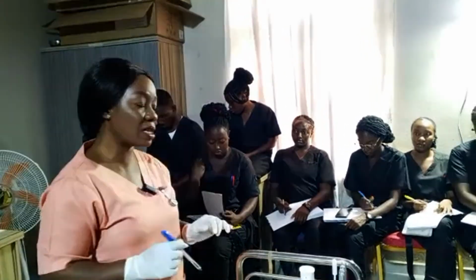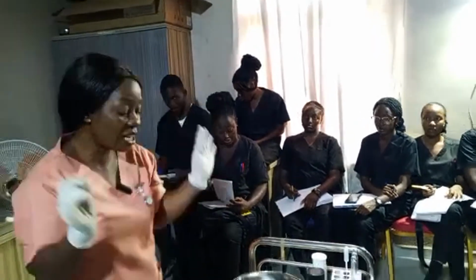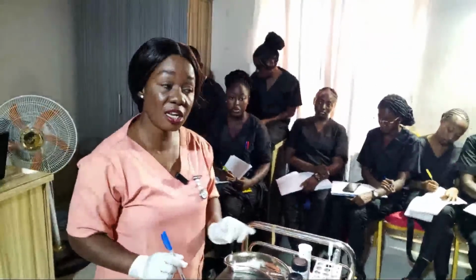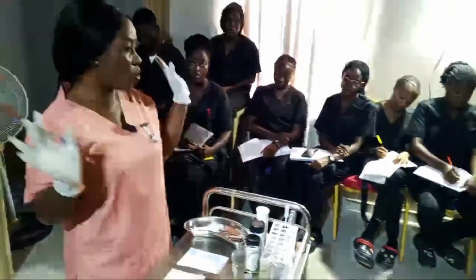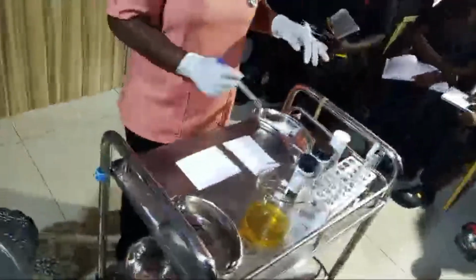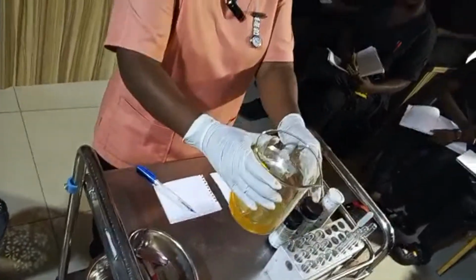So let's go ahead. Let's look at the physical examination. Forget that I did not touch any urine. It is very important that you do physical examination of the urine. So avoid contaminating everything. I keep it this way. Let's look at this urine, right?